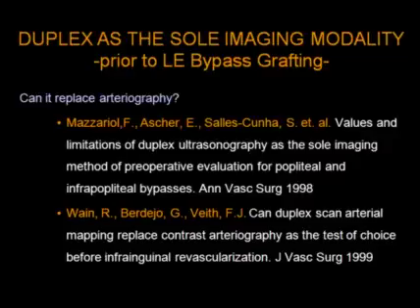With the evolution of the technology, we further sought to answer the question, was duplex good enough as a sole imaging modality prior to lower extremity bypass grafting? The group in Brooklyn, Dr. Asher's group, have been huge proponents of this technique in this setting, and they published a paper in 1998 titled Value and Limitations of Duplex Ultrasonography as the Sole Imaging Method of Preoperative Evaluation for Popliteal and Infrapopliteal Bypasses.